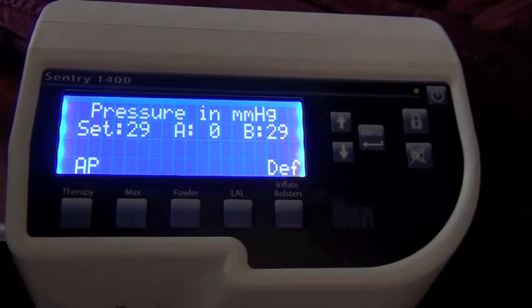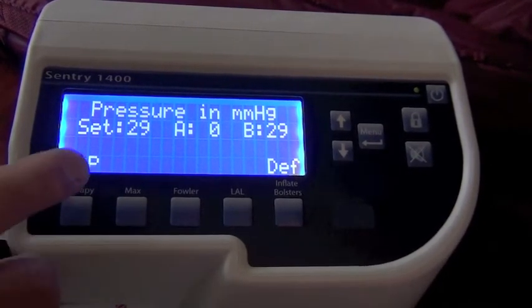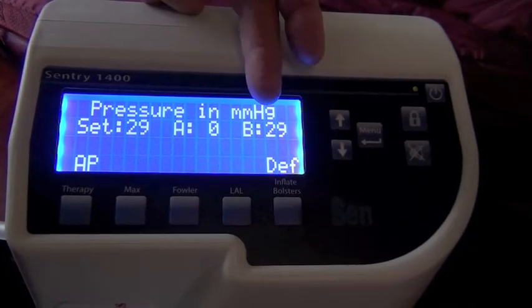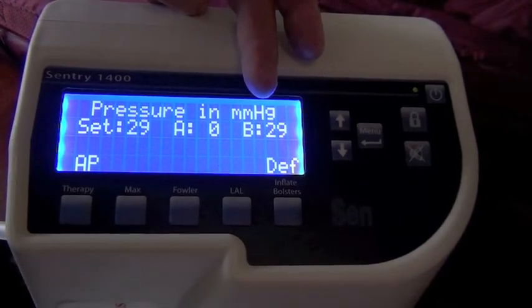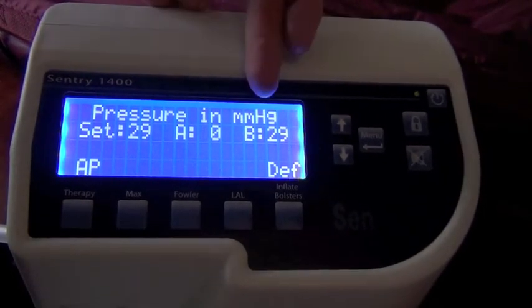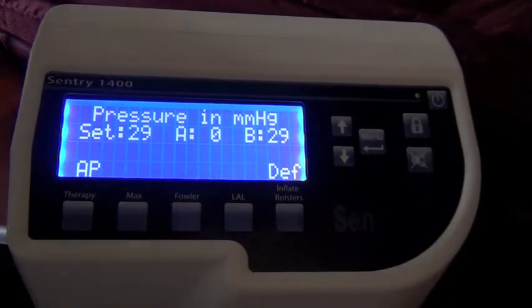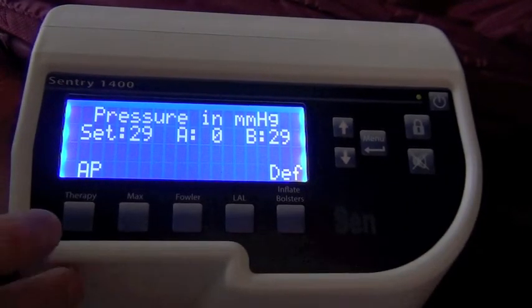That's the beauty of alternating pressure therapy. This occurs every 5 minutes on this system. So every 5 minutes we're switching from A to B. We're switching from cells that are inflated to cells that are suddenly deflated. And the deflation process probably takes less than a minute to transition from one to the other. Again, subjecting tissue to pressure for 5 minutes and then offloading that tissue for 5 minutes. And we're doing that continuously around the clock. So it's a very aggressive, very effective pressure management tool.